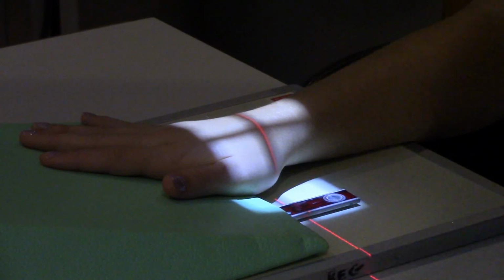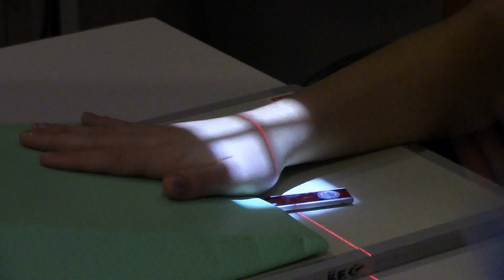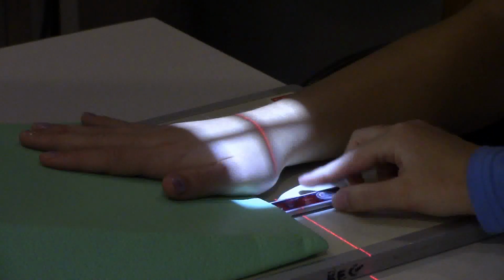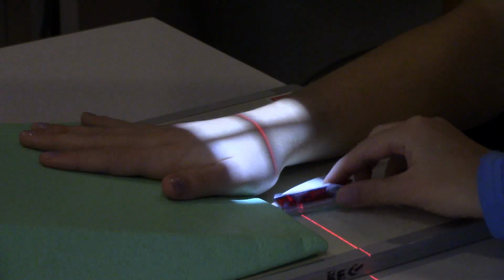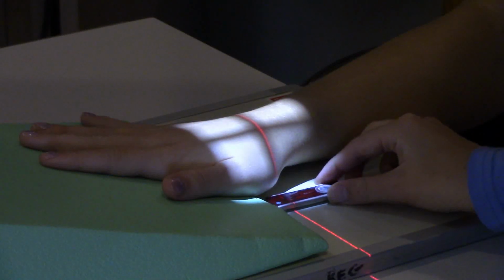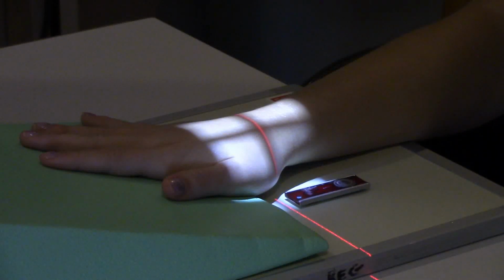Do you have to collimate anymore? Is that good collimation? Yeah, well, okay, you can collimate pretty tight for this. You don't necessarily have to include all the carpal bones. But at the same time, you don't want to cone off your marker. So yeah, you could collimate down to like a 4x4 square. Does your marker usually go laterally? Marker goes lateral unless there's some reason why you can't do it. For a lot of things, it's towards the bottom. But there again, it depends on the anatomy you're trying to demonstrate.